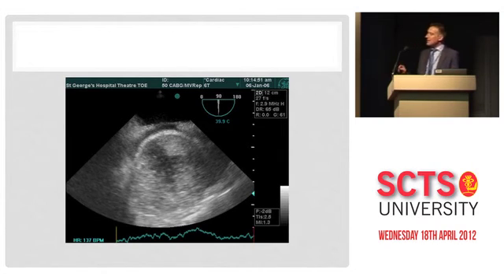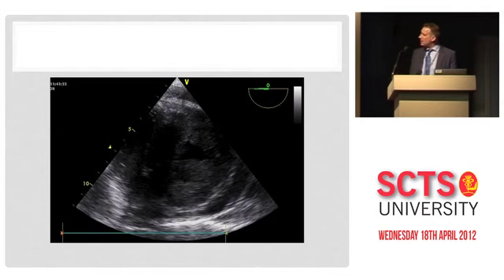Well, it actually is a right atrial thrombus, but the thrombus actually lies outside the right atrium, and you can see that concavity, and that's a post-operative large clot pushing the right atrial wall in. It's actually squashing that right atrium completely down, and having a look around, you could see other evidence that there was bleeding around the heart.